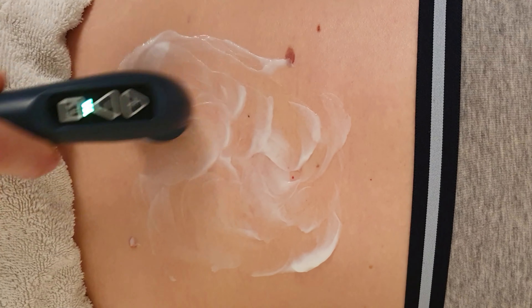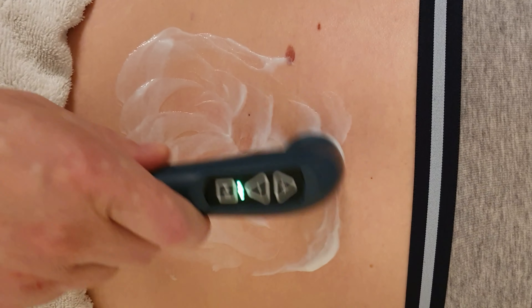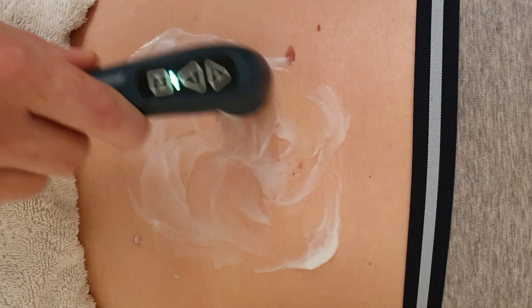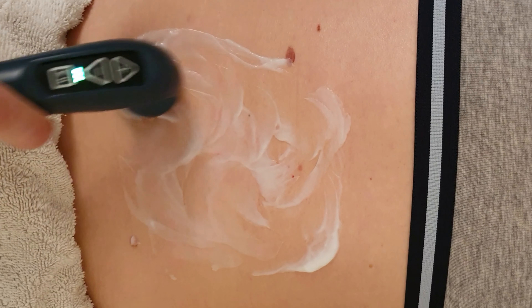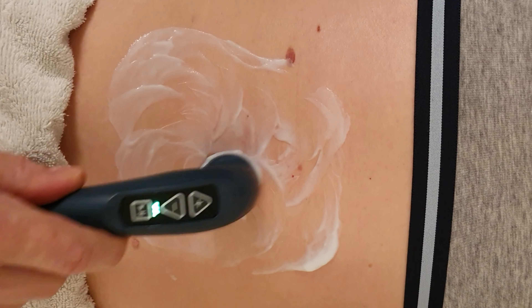At 8 minutes, you'll be able to cover a large area — 8 times the treatment head size — working on my principle of 1 minute per treatment head size. We'll work around here in small circles, trying to take the tension out of the muscles.